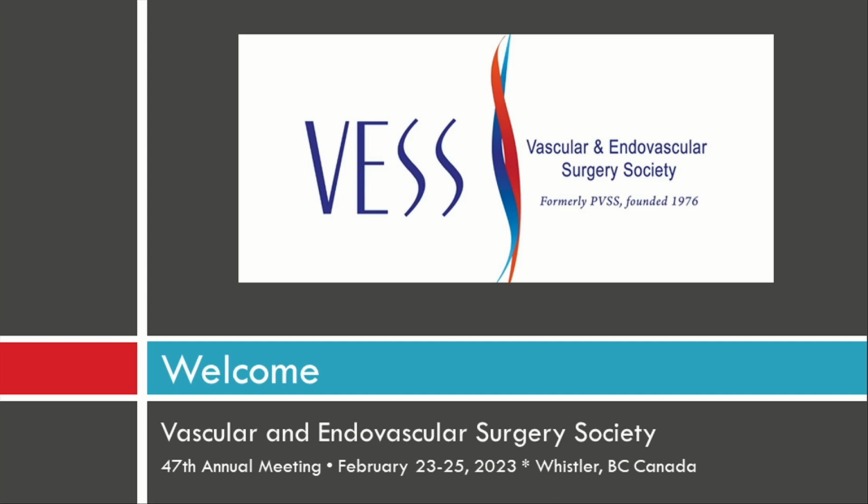So we did not have a formal protocol in place, so the operating surgeon would do the ultrasound. It takes about 5 minutes. They used a cutoff of around 3 millimeters. But other than that, there was no formal protocol, which we would love to consider implementing in the future, and we would suspect that in doing so, that might actually increase the beneficial results even more, just because we would like to have more of a protocol so that you're actually looking at the full length of the arm and making sure that you're getting the best possible site.